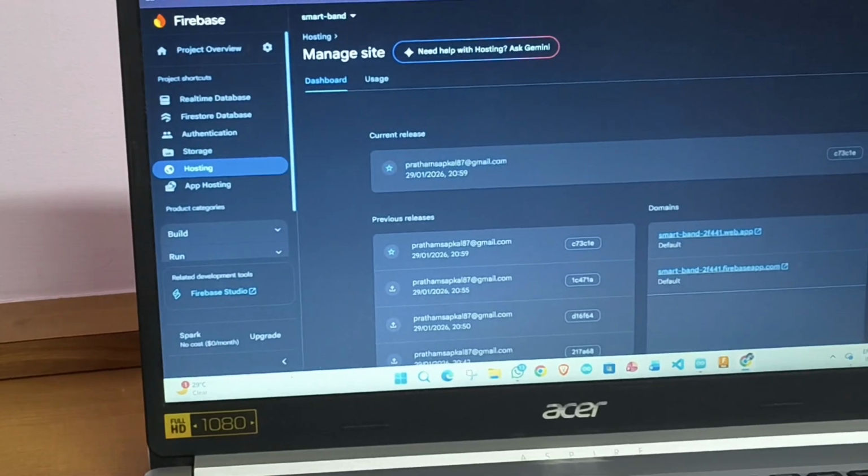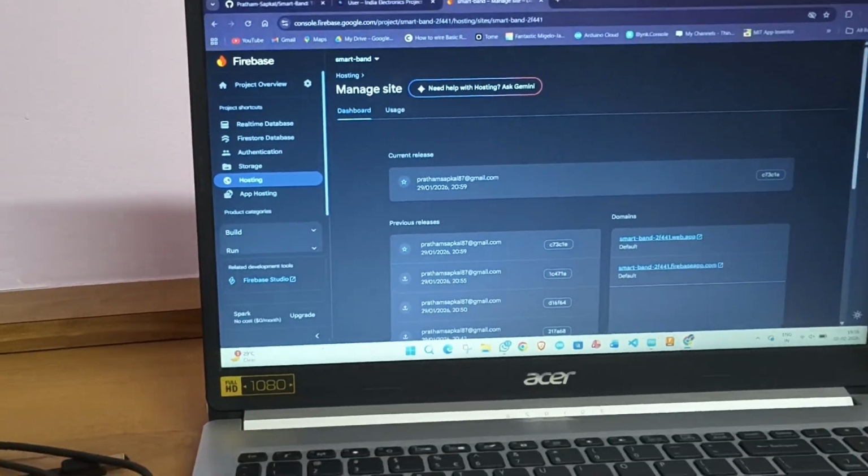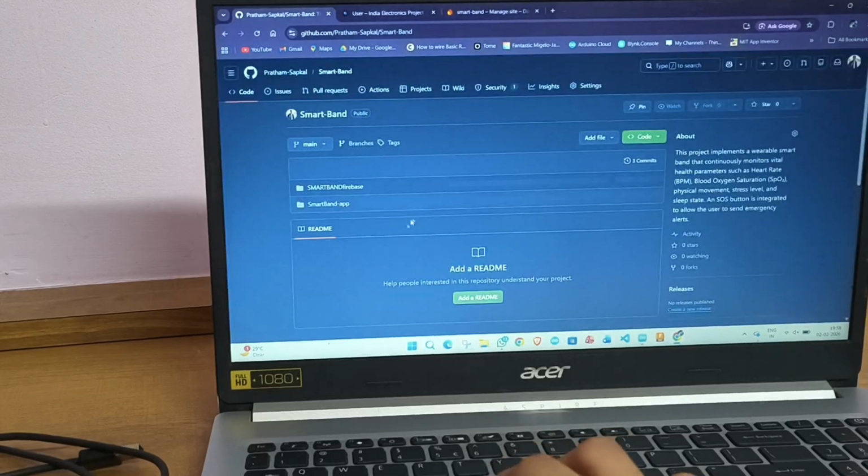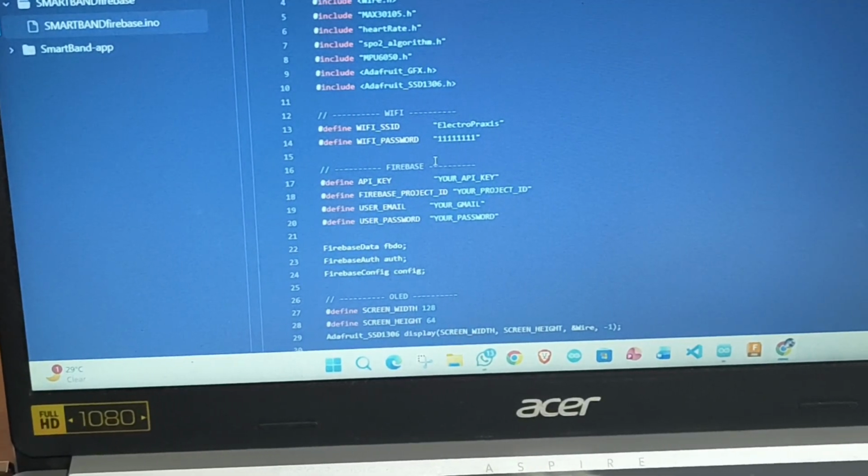Also, I have uploaded this project on my GitHub. So now I will explain the code. So this is the SSID and the password.